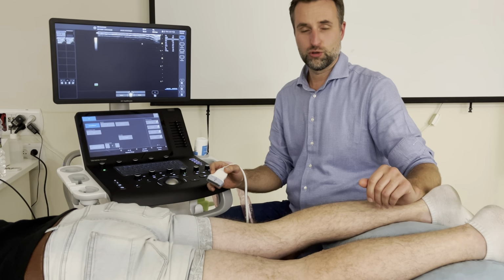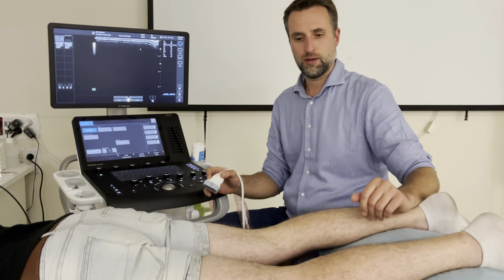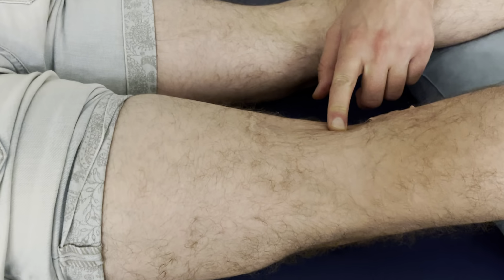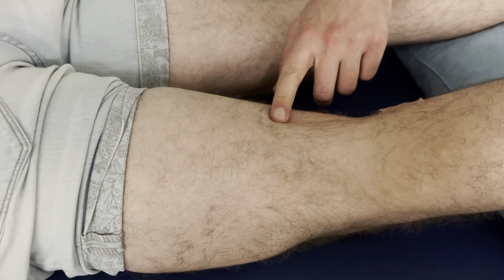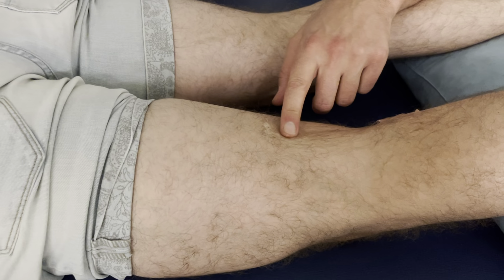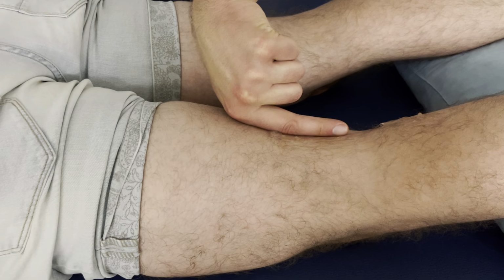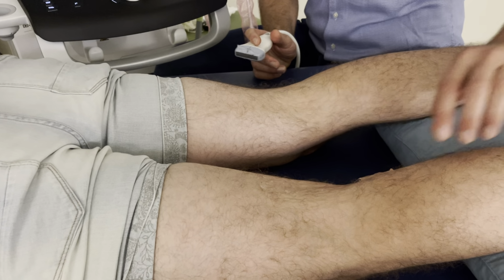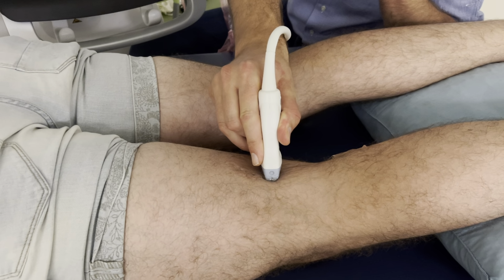We're going to take a look at the dorsal knee for the location of a possible Baker's cyst. Therefore, before we go exactly to the location, which is here, it's sometimes difficult to find if you're inexperienced, so it's easier to start more proximal. Because more proximal here, we will have the semitendinosus tendon in this direction, and just beneath it, we will have a muscle belly.